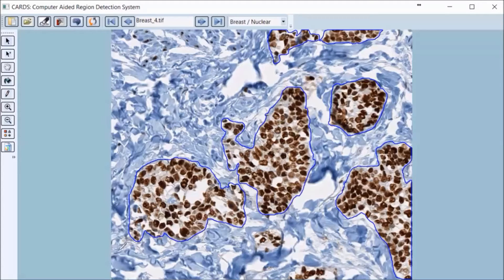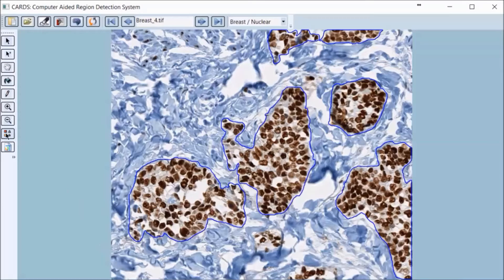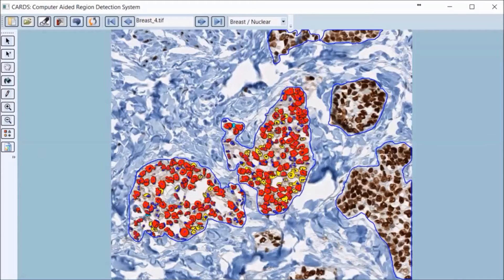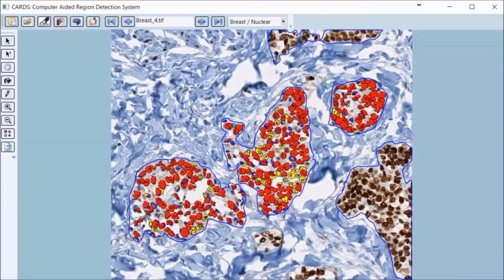The algorithm working in the background can also detect individual cells inside the tumor, highlighting the membrane, cytoplasm, and nucleus based on its staining properties.